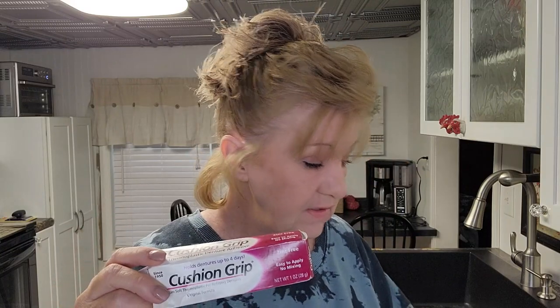Have you ever had your tube of cushion grip bust out on the bottom? I've been getting a lot of questions — people want to know what the difference is between the cushion grip and the gum guard putty.